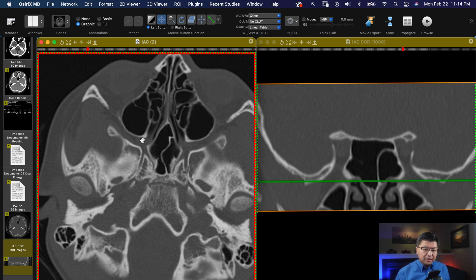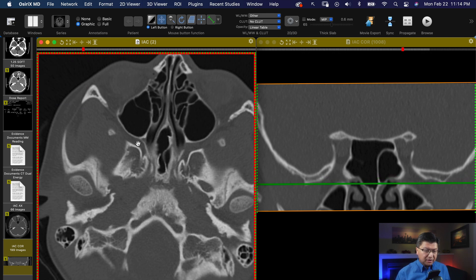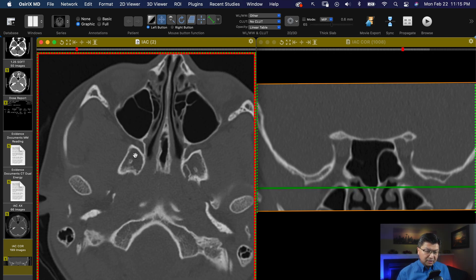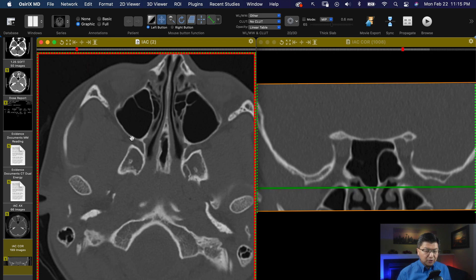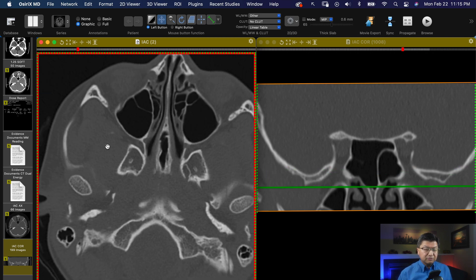Going back to the pterygopalatine fossa and moving down a little bit, the space going laterally is what we saw from the external world in the 3D reconstruction — this is your pterygomaxillary fissure. Here is the maxilla, and if you punch a hole through it you'd go right into the maxillary sinus. Over here, this bone is part of the sphenoid with the lateral and medial pterygoid plates. Exiting laterally through the pterygomaxillary fissure, you get into the infratemporal fossa — named because right above it is your middle cranial fossa where the temporal lobe lives.